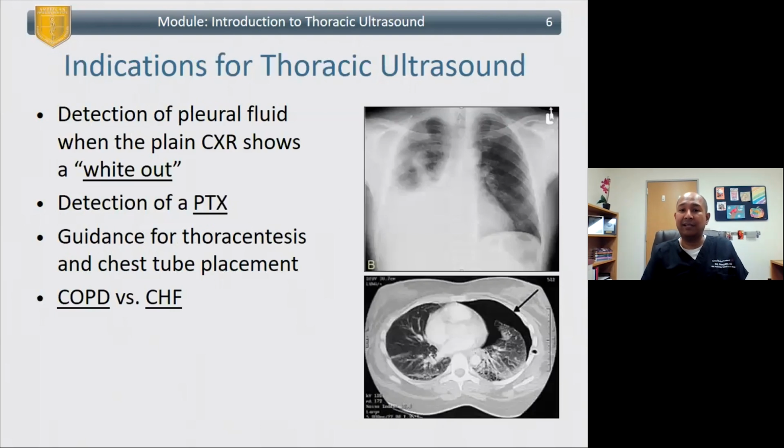So what are the indications for lung ultrasound? Well, I would say the most common thing is this chest x-ray right here. And I always say to my fellows, describe what you see. And in this chest x-ray, I see a density involving the right middle and right lower lobes. How do I know that? Well, I don't see the diaphragm, so the right lower lobe is involved, and I don't see the right atrial border. It's silhouetted off, so the right middle lobe is involved.